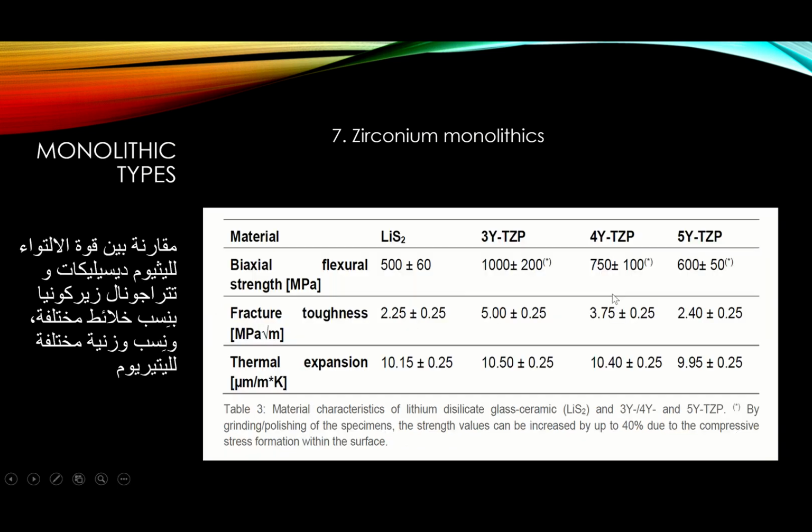All right, we're still talking about this block from Ivoclar Vivadent, which is Emax Zircad, like I indicated before. Zirconia block, still they call it Emax, but it's a zirconia block. Emax Zircad, zirconium block from Ivoclar Vivadent, when we're taking it as an example.